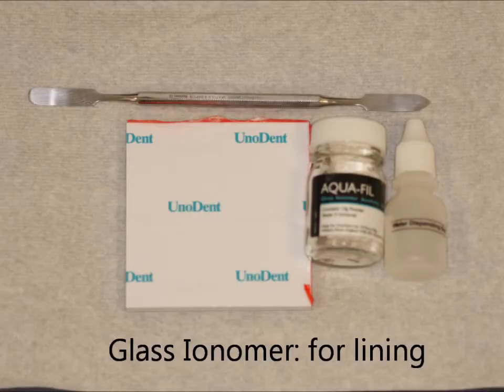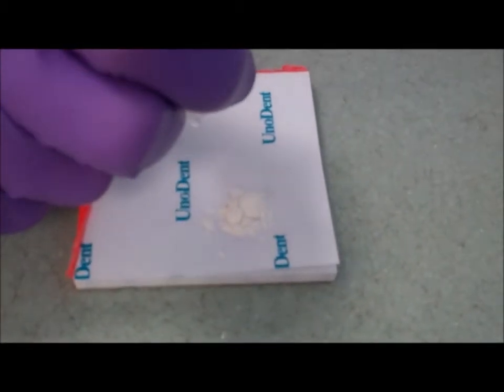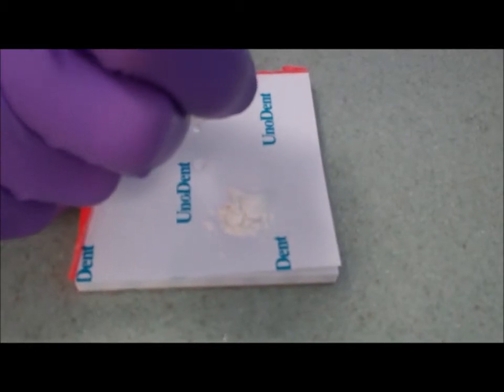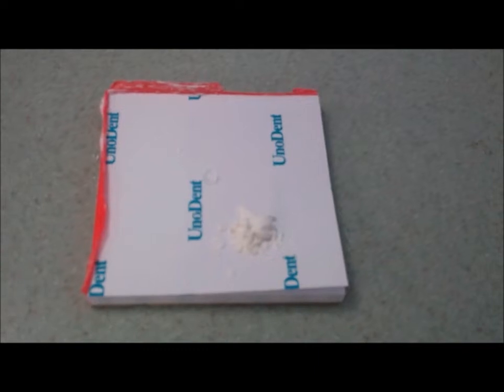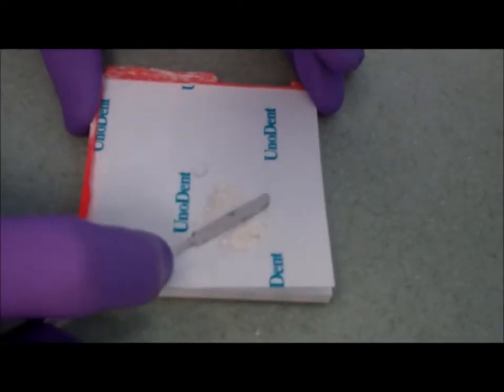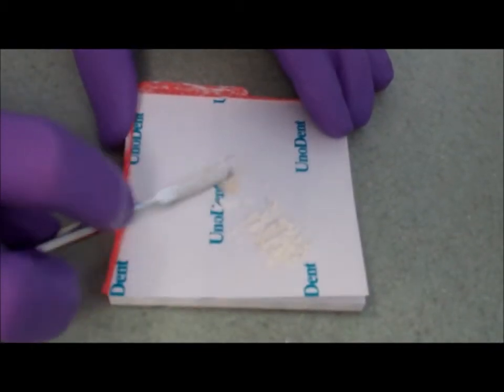If you're using glass ionomer as a lining material, you're going to take enough powder, usually a couple of scoops, and put out an equal amount of water from a dropper. A dropper bottle needs to be held directly upright to get a proper sized drop. Segment your powder into increments, and then just add a small amount of powder mixed in well each time.